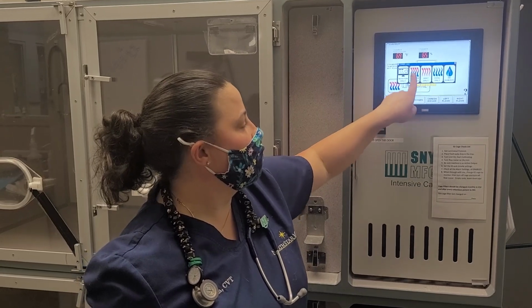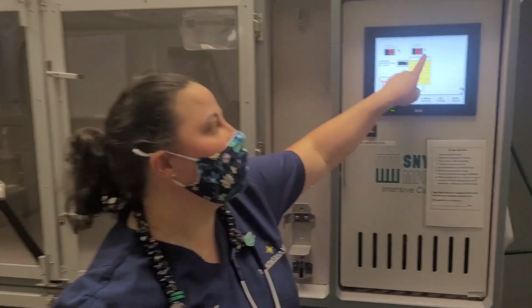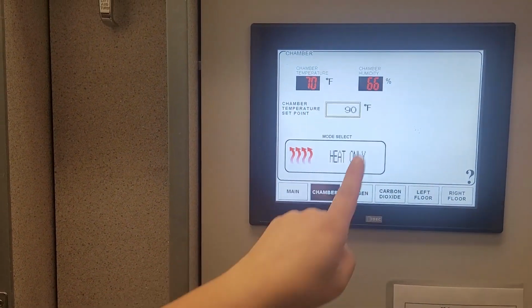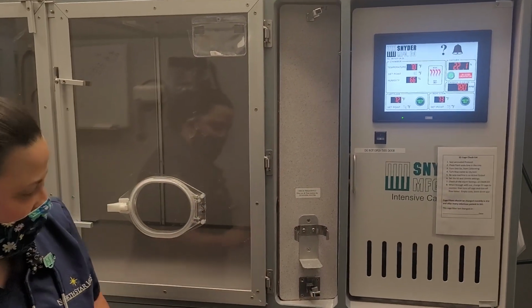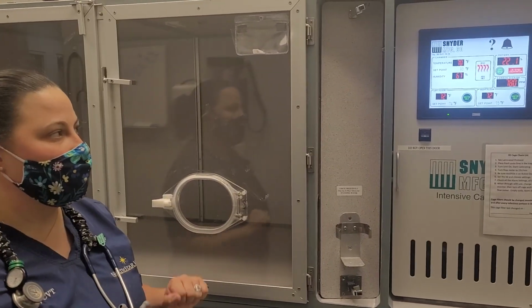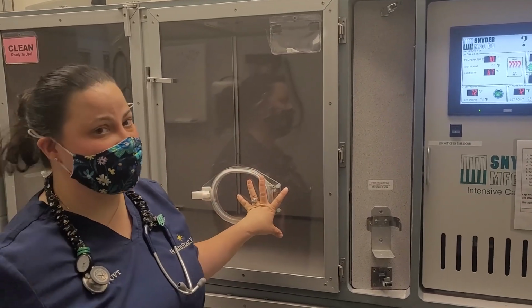Well, you're going to go to heat since it decided to offer that to me. You're going to change it to 90, hit enter. You're going to go to your climate control and put heat only. You're then going to want to crack your doors so it doesn't get too hot. And then that should give it about a half an hour or so, and that should probably clear up your humidity problem, and that will defrost your condenser for you.